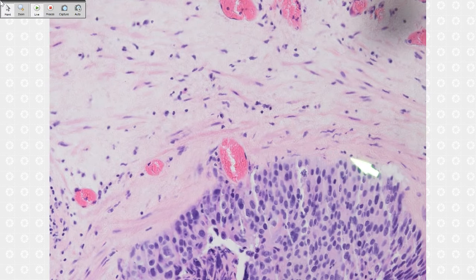Dr. Haynes also mentioned the staging if there's stromal invasion. It's not like going through to another organ. Would you consider this one as stroma invasion? No, it doesn't count, because the border is very similar. That's why this is complete.